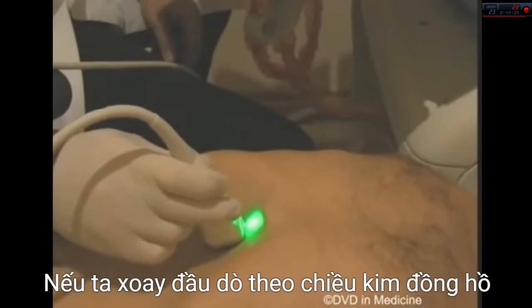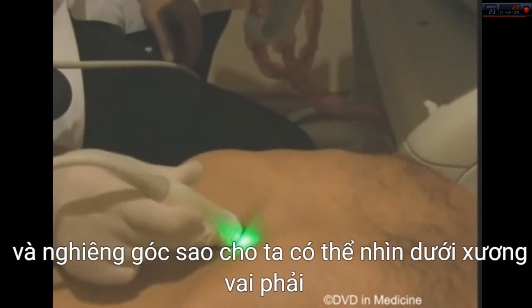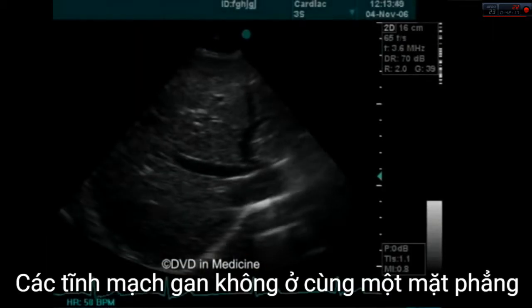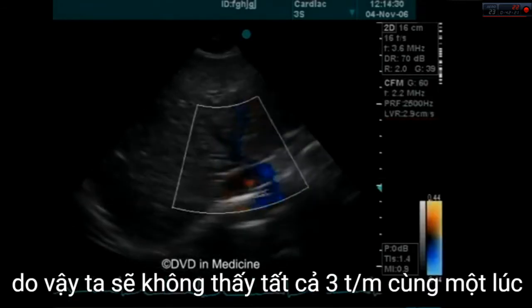If one rotates the transducer clockwise and angles it so that one can look under the right scapula, one will see the area where the hepatic veins connect with the inferior vena cava. Hepatic veins are not positioned in the same plane, so one will not see all 3 veins at the same time.